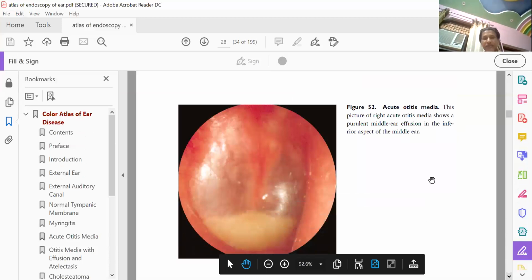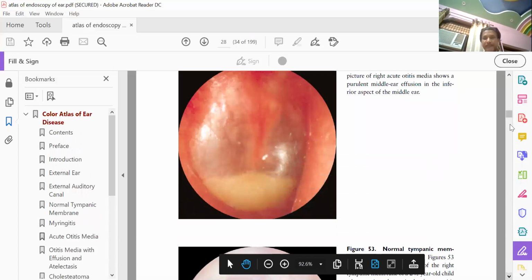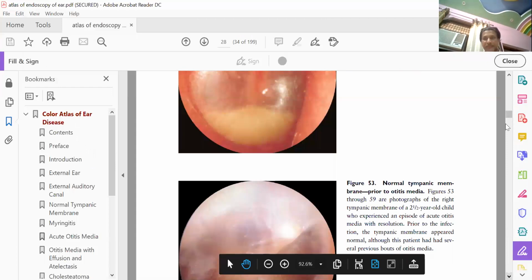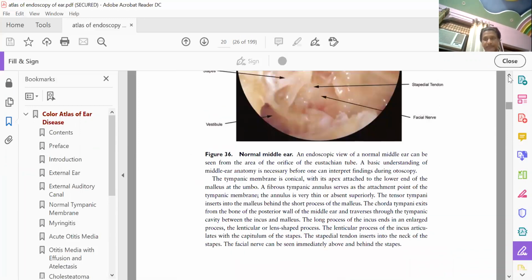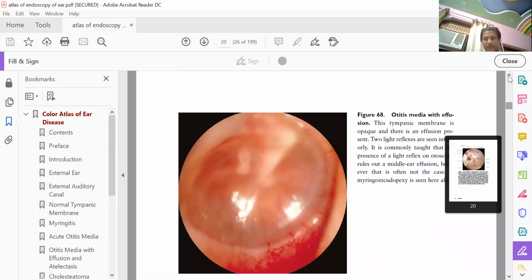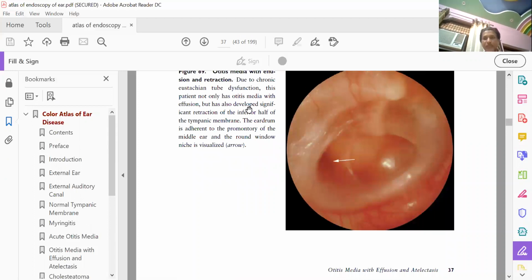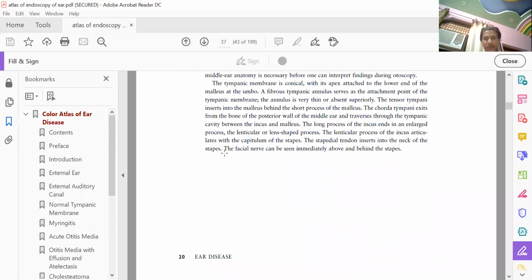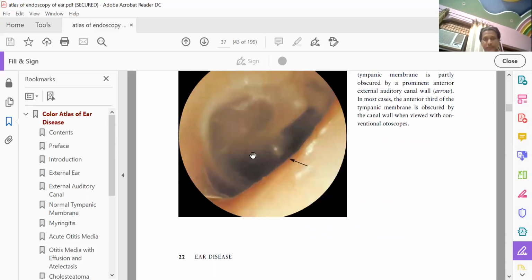Let me centralize it. Okay, you can see that this is, sorry, okay, give me a minute. Oh, okay, no. Let me take you to this.